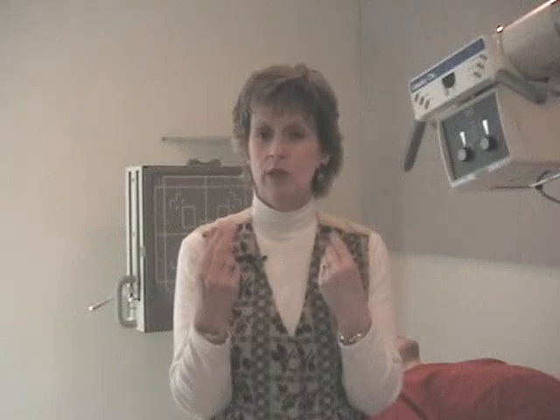And if one is smaller, try to remember, what does that mean? Which way was the patient obliqued? If the right side is smaller, what oblique was that? Slight RPO. You'll remember that from your discussions on your pelvis exam. You can also look at the ischial spines. They should be equally seen on both sides. If one is more dominant than the other one, that means that side was closer to the film. So you're looking at the overall shape of the pelvic inlet. The structure should be equal distance to the lateral edges. Look at the obturator foramen. Look at the ischial spines.